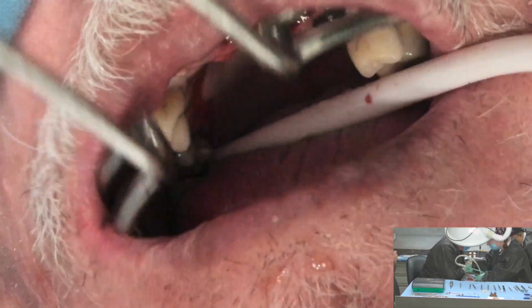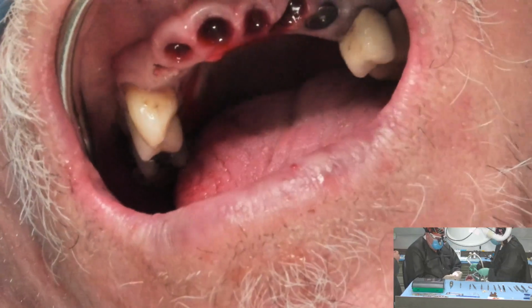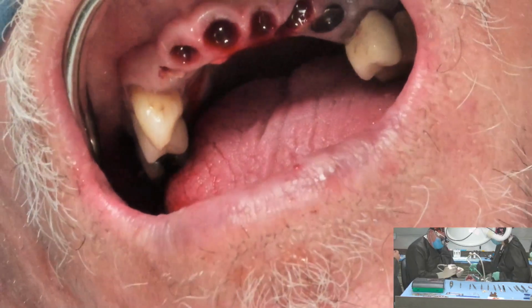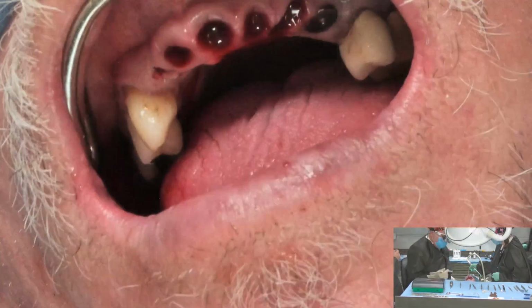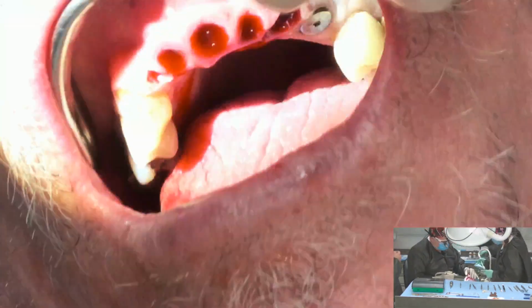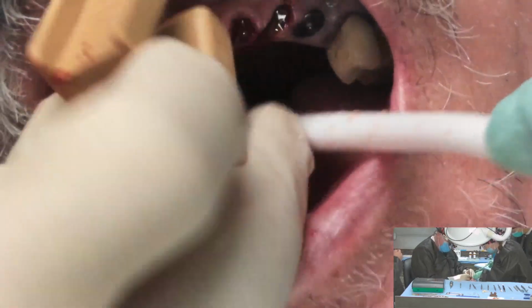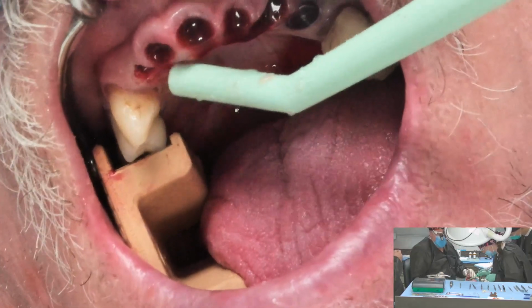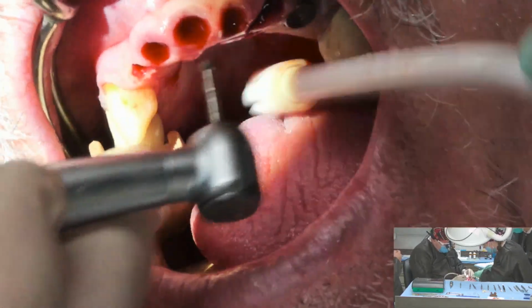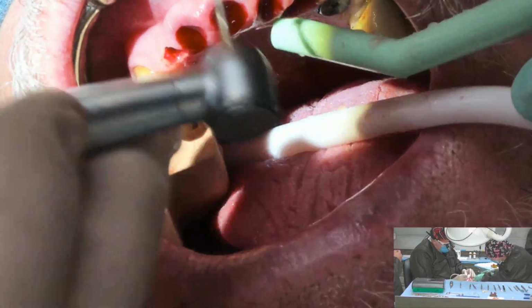Okay. Now, this one, perfect. So now what we're going to do too, since we've got our site already set up, we're going to start the debridement phase. The debridement phase is that we start off the day before the procedure with Alan taking an antibiotic. Let's open up again, Alan, for me. This will relax your jaw. Perfect. She'll get out the water, okay? Augmentin, he started the day before the procedure, 2 days before the procedure.